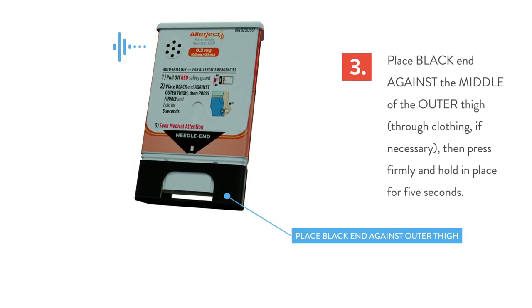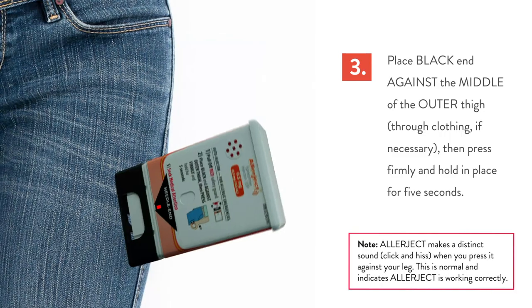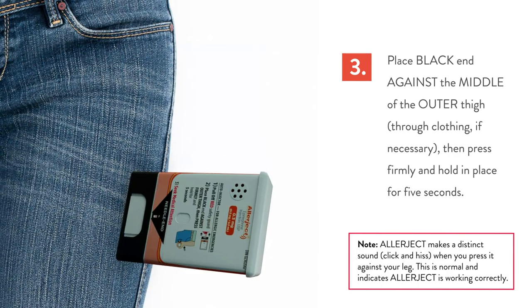To inject, place black end against outer thigh. Then press firmly and hold in place for 5 seconds. 5, 4, 3, 2, 1. Injection complete.